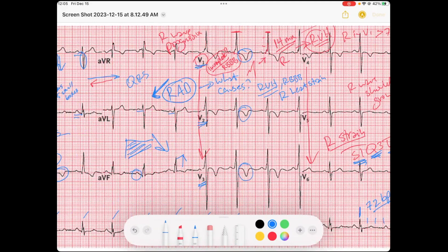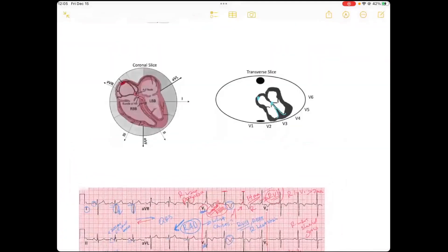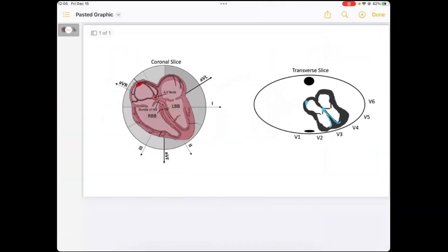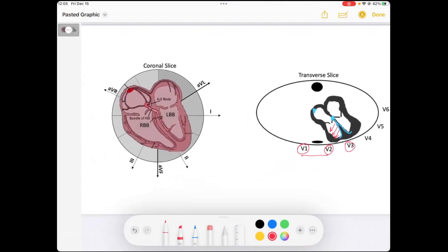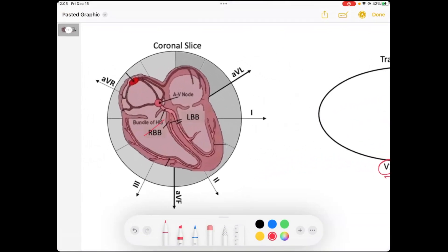That makes sense when you look at the distribution of our precordial leads — any depolarization of the right ventricle will be sending signals captured primarily by V1 and V2, and somewhat V3. In the limb leads, those signals will be captured negatively by our lateral leads, specifically lead one.